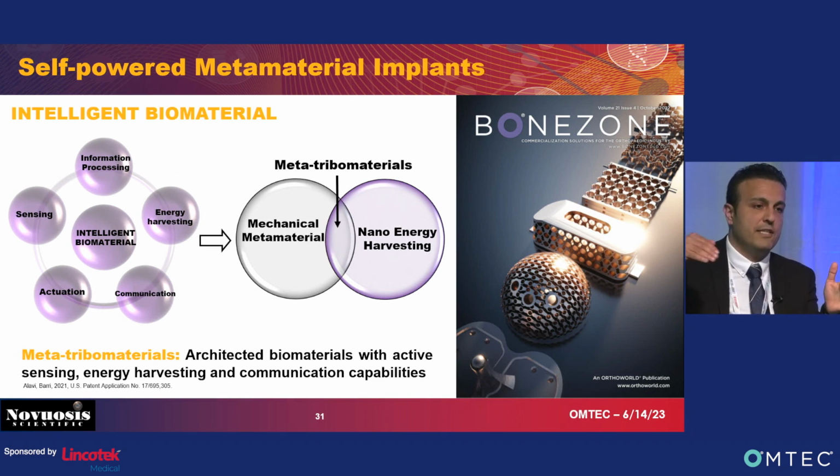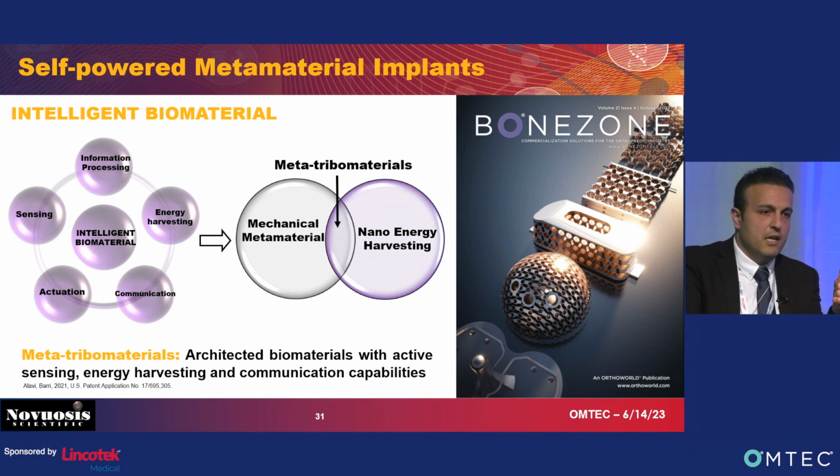Now, what we do additionally is introduce this nano energy harvesting technology, which results in an implant that is not only mechanically tunable. At the same time, it can harvest energy, it can sense, and it can also generate electricity for electrical stimulation.